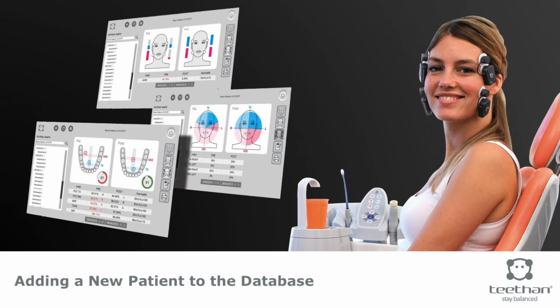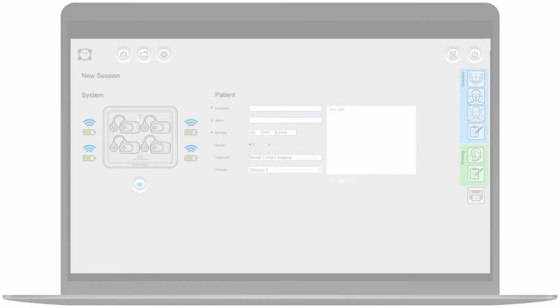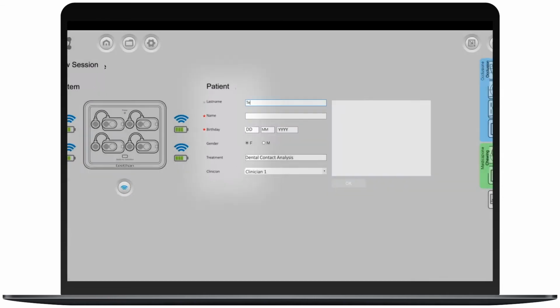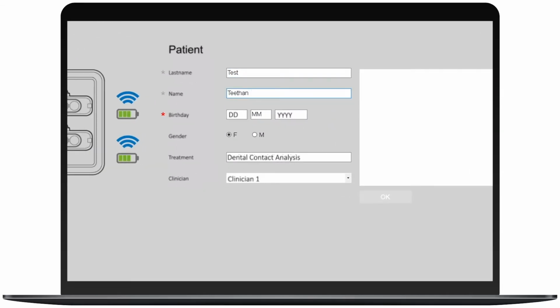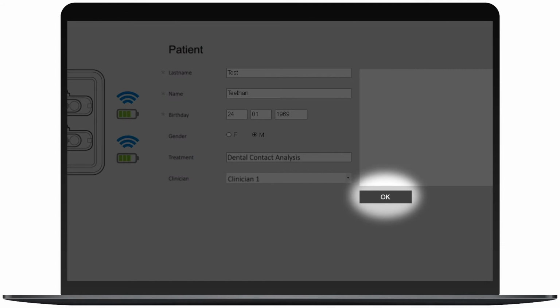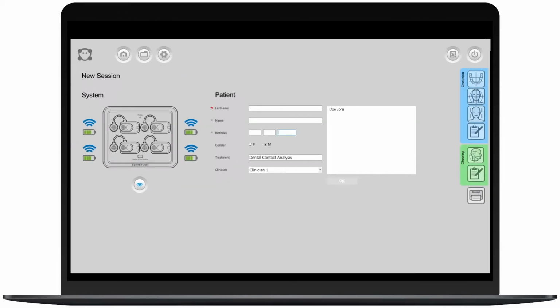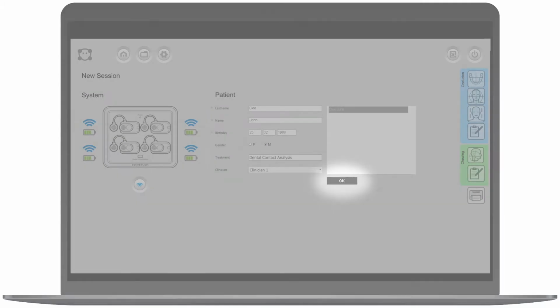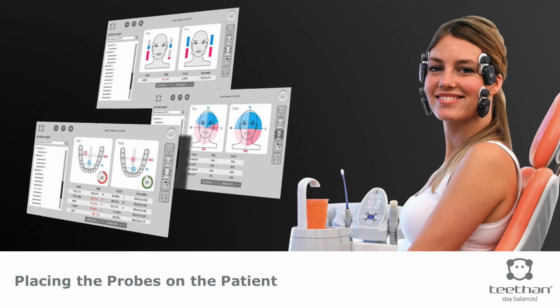Adding a new patient to the database. To insert the patient data, fill in the surname, name, date of birth, and gender. Once all the fields have been completed, click OK. If you would like to recall a patient previously tested, start typing in their surname. Select the patient and click OK.